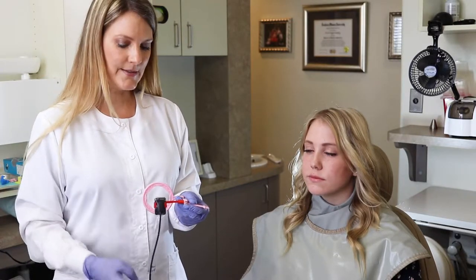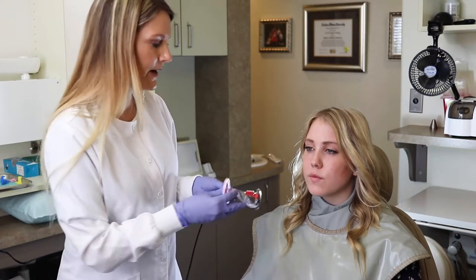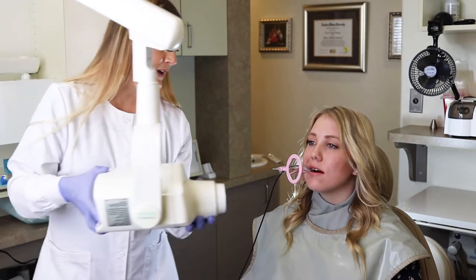Get your Dream Sensor by Dentimax positioned properly, go ahead and wrap that cord softly around, and go ahead and open — and that is how you place the vertical bite wing.